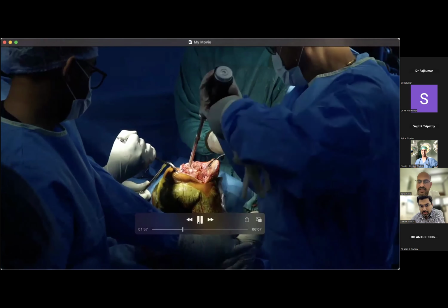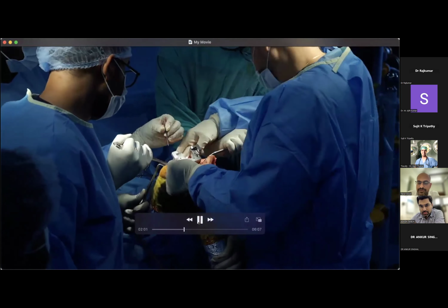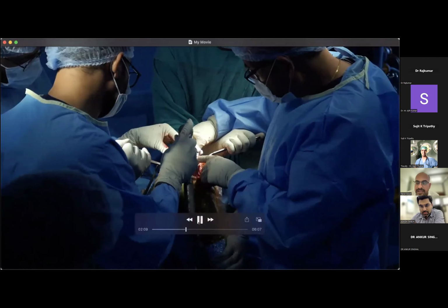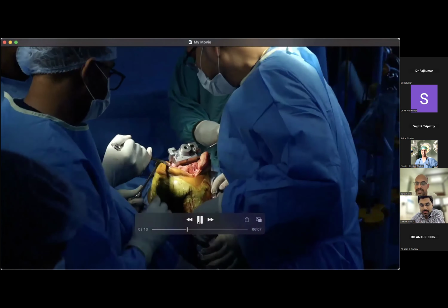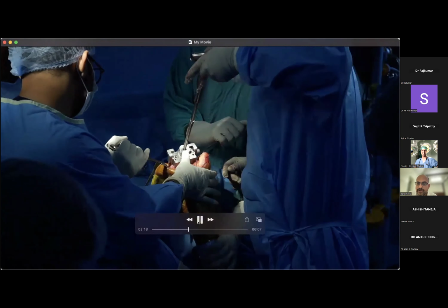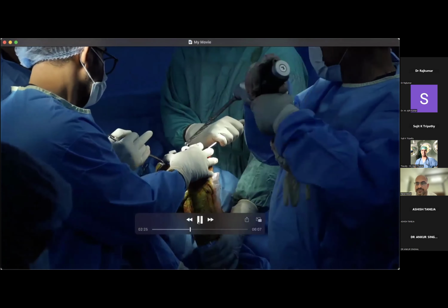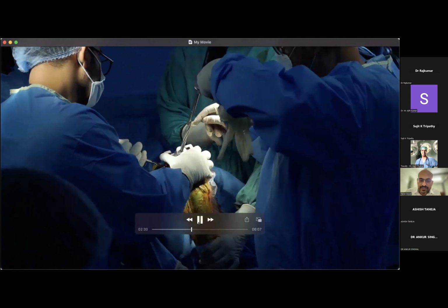This is creating the canal on this side, and based on the length of your intramedullary rod you're looking at, you'll prepare the canal. And this is the LCK system by Zimmer, and we are preparing the anterior and the posterior cut along with reaming the medullary canal. Again, on this side, we have used the centric jig because we didn't need any offset depending upon the alignment of the femoral component. Sometimes you may need offset components, so they should always be available with you when you're doing a revision arthroplasty case.